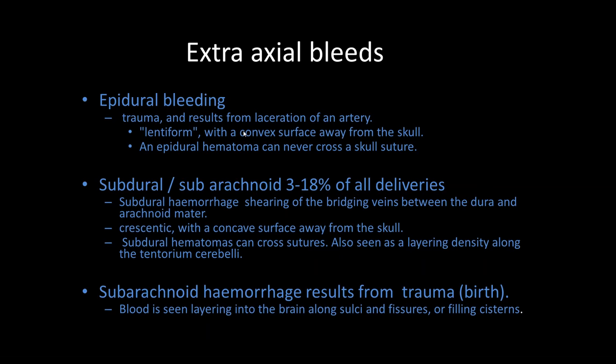Epidural bleeding generally results from trauma, and it's lentiform with the convex surface away from the skull. The subdural and the subarachnoid actually occur within normal deliveries, about 3 to 18% of all deliveries, according to CT scans that were done in the late 80s. Obviously, most of these are asymptomatic. And then you can get quite symptomatic subarachnoid hemorrhages resulting from birth trauma.